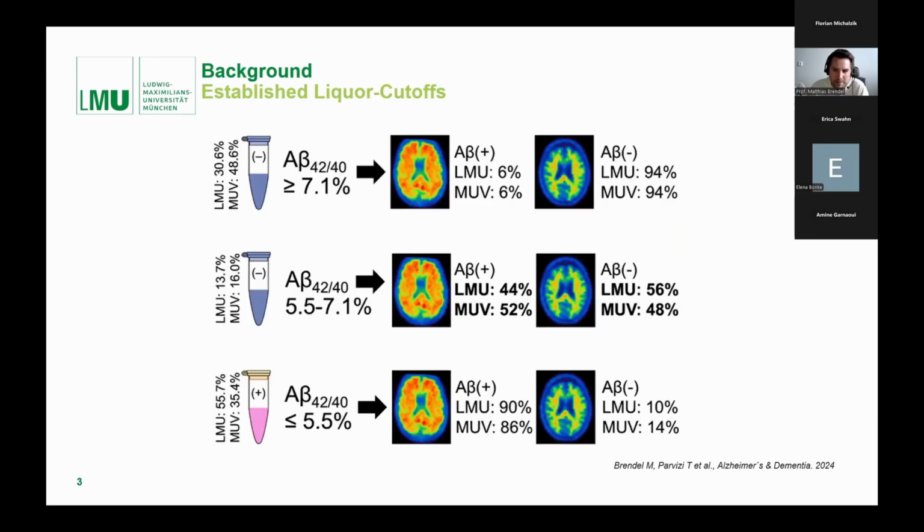We have also asked the question to our own data: how to best assess the amyloid status of individual patients. And I think this is a very relevant slide because it shows you that there is in principle not a clear answer with only one of the tools that are available. So what we propose is a joint algorithm of CSF and/or blood markers that will appear soon, and then also PET imaging. And why is this important?